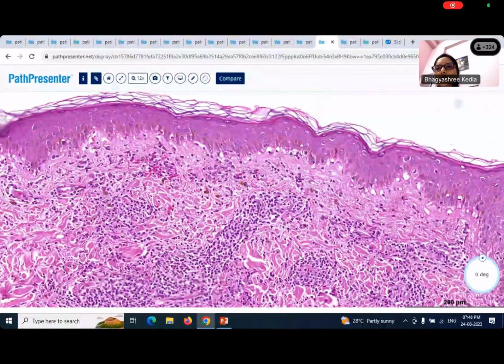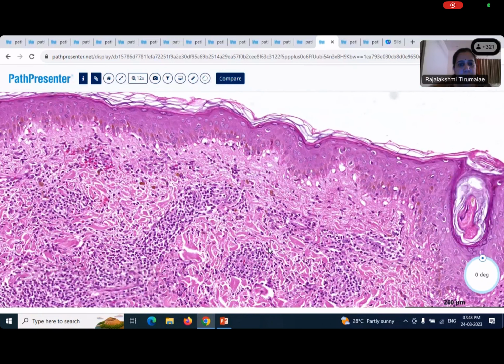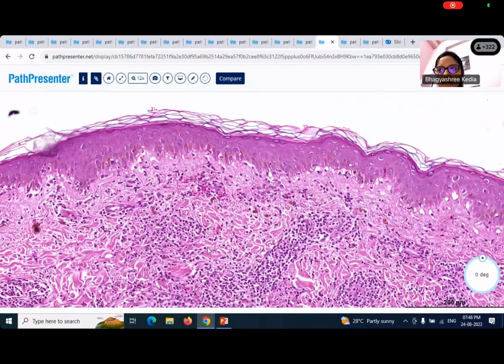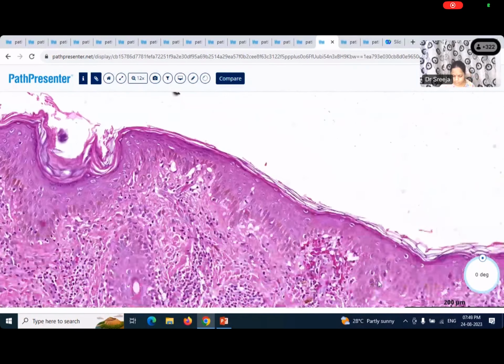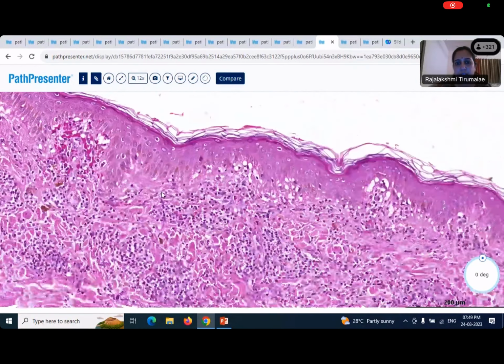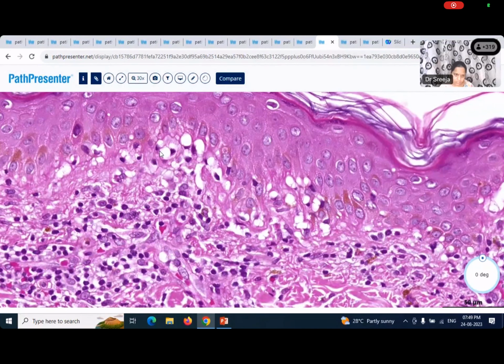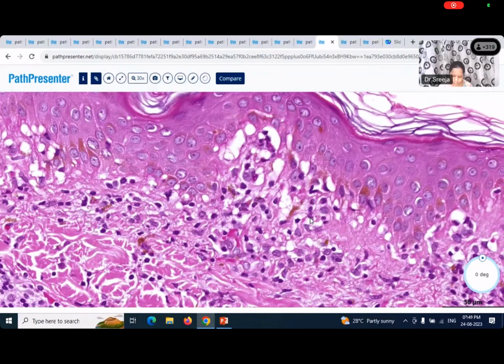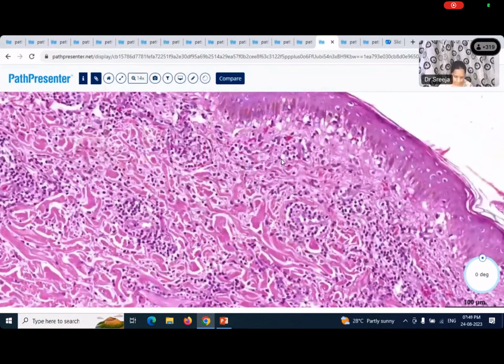So you feel the epidermis looks normal? And basket weave appearance. Okay, that's about the stratum corneum. But what about the epidermis? I'm showing you something in this field. Can you identify what the change is? Do you think the thickness of the epidermis is normal? Are you able to see the retae everywhere? Are the retae well preserved? I'm just showing you across the entire biopsy. What do you think is happening here? I'm pointing to some areas here. You can see that here also.